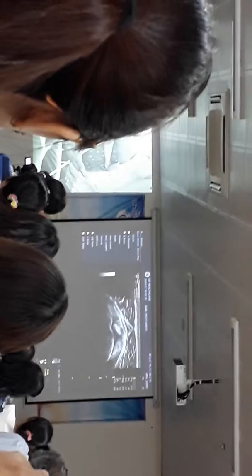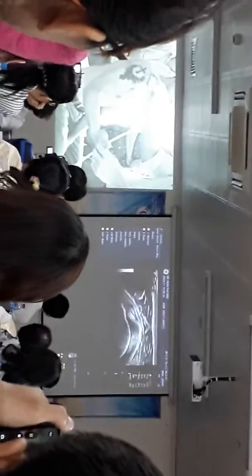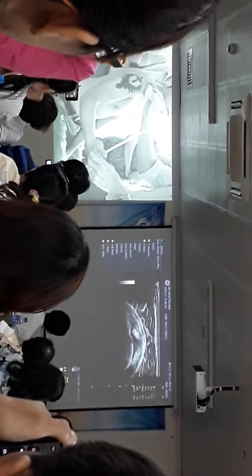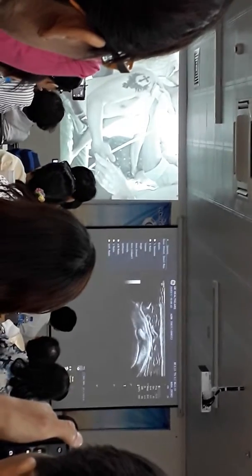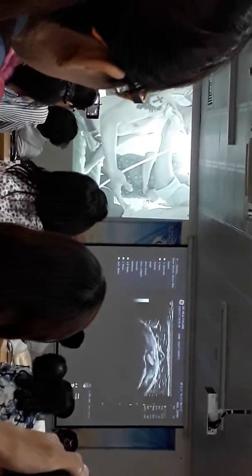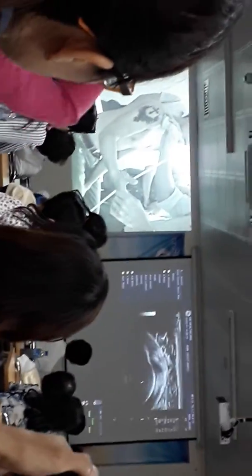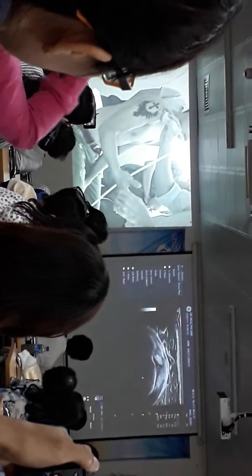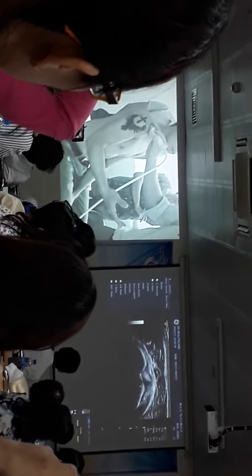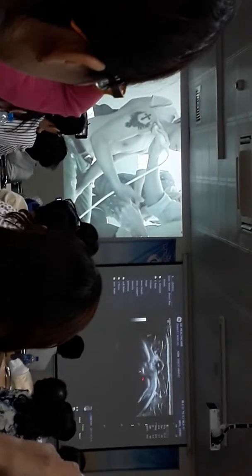So to check the integrity of the rotator interval or the biceps fully, I just gently internally, externally rotate the arm. Mình kiểm tra sự bảo tồn của đầu dài cơ nhị đầu cánh tay bằng cách yêu cầu bệnh nhân xoay cái bàn tay ra ngoài, xoay vô trong. And I want to make sure that all of these structures are moving together. Và bảo đảm mình thấy rằng ba cái cấu trúc này di chuyển với nhau cùng lúc. And that this long head of biceps is staying within the groove. Cái đầu dài này nó vẫn nằm ở vị trí của nó, vẫn trong cái rãnh nhị đầu.